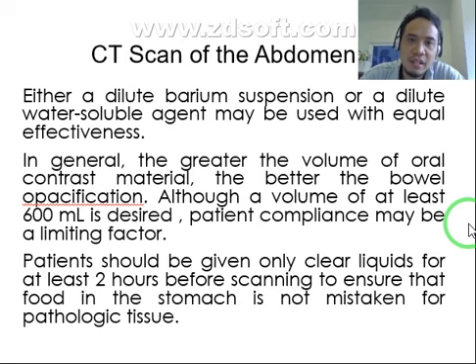In general, the greater the volume of the oral contrast material, the better the bowel opacification. Although a volume of at least 600 ml is desired, patient compliance may be a limiting factor. Okay? So, ang pinaka-desired nga volume sa atong oral suspension is 600 ml.